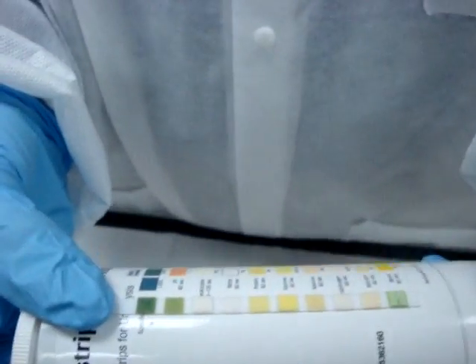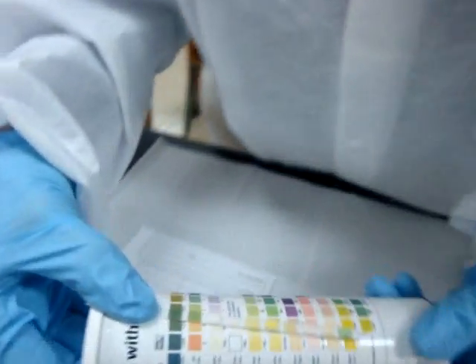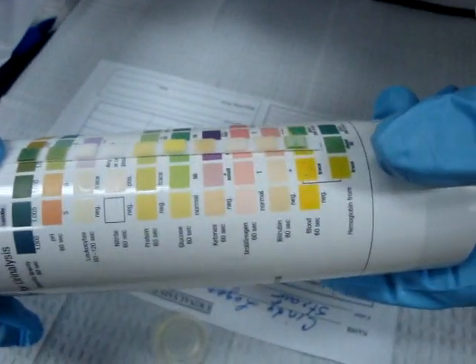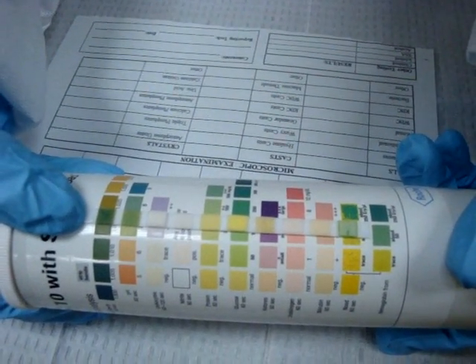It has been one minute, and I want to reiterate that timing on these chemical strips is critical. We come over here with our pH — we don't read specific gravity — and you can see this pH is 8.